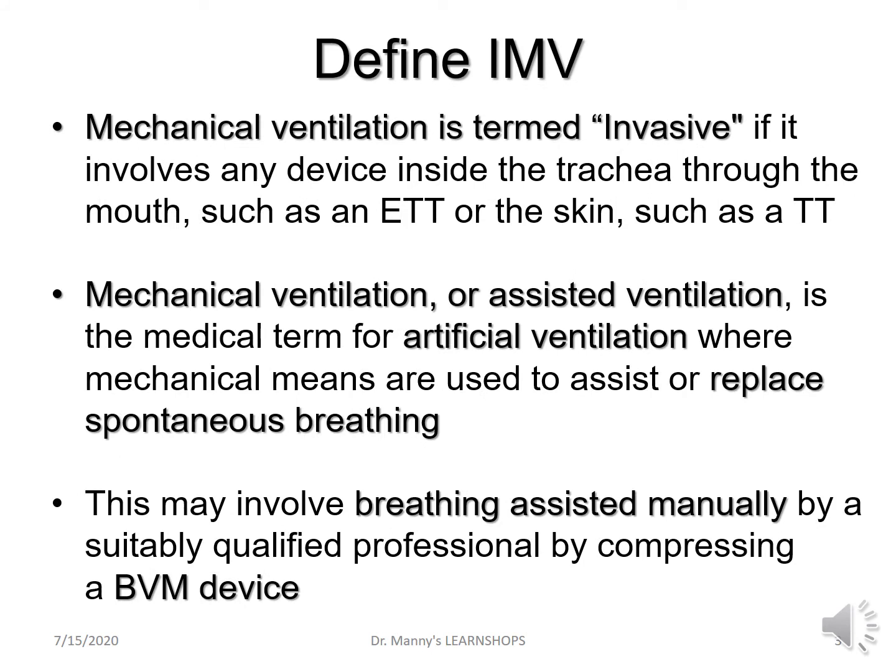Mechanical ventilation is termed invasive if it involves any device going inside the trachea, through the mouth, such as an endotracheal tube, or through the skin, such as a tracheostomy tube. Mechanical ventilation or assisted ventilation is a medical term for artificial ventilation where mechanical means are used to assist or replace spontaneous breathing.